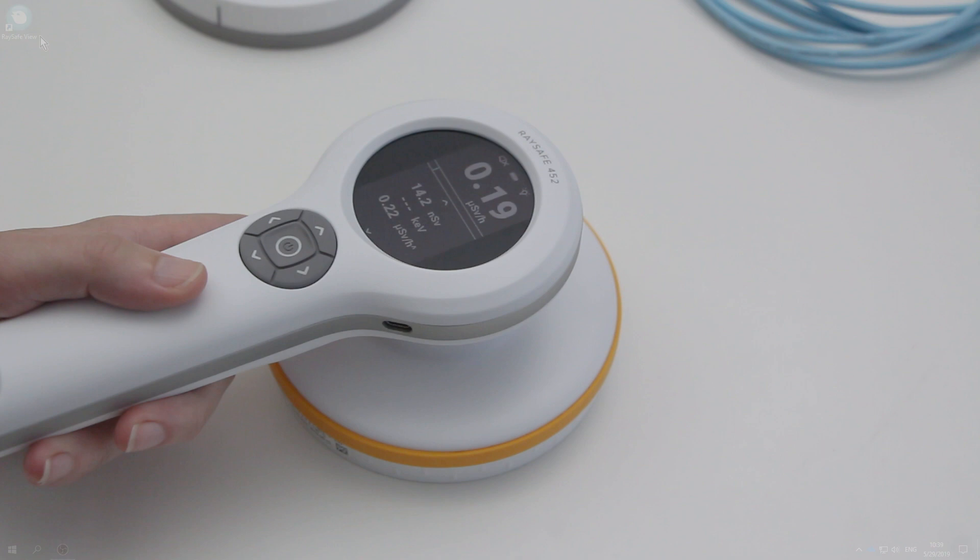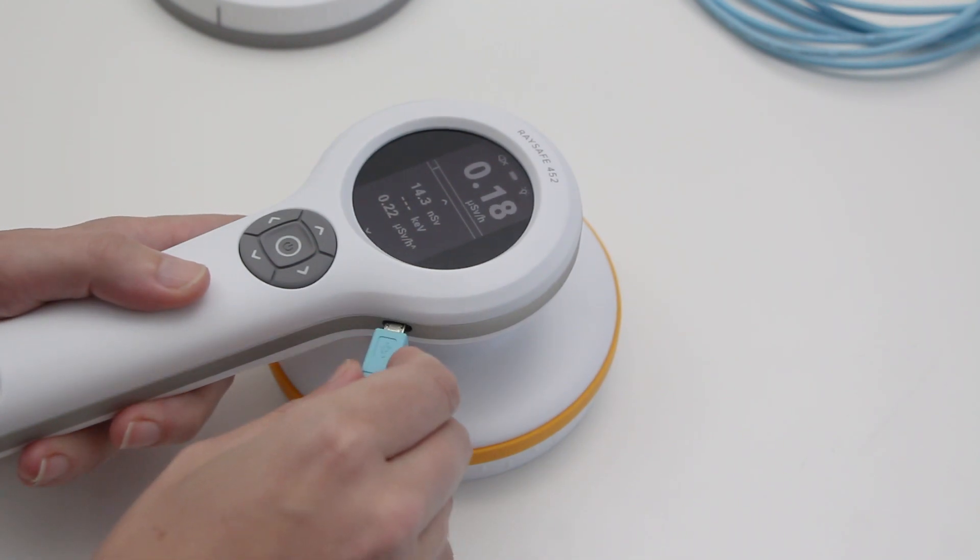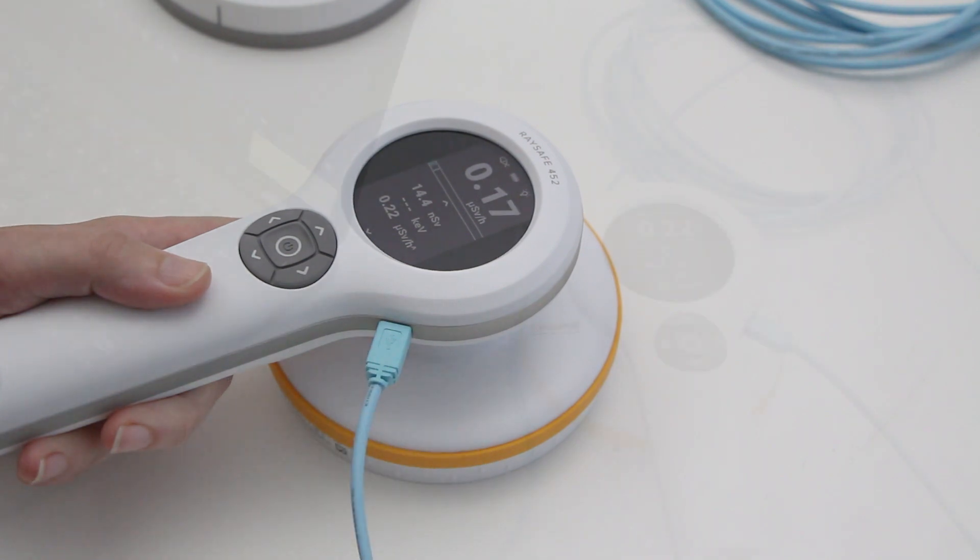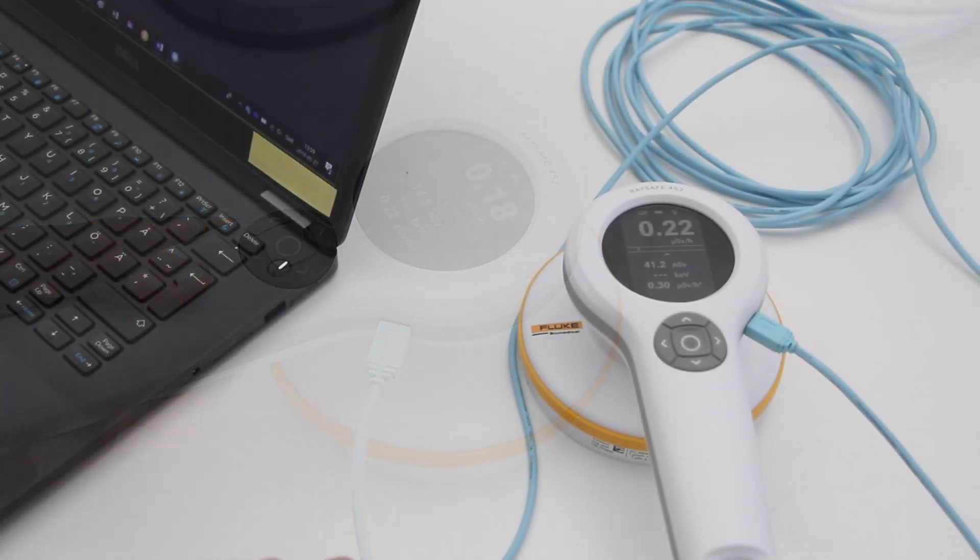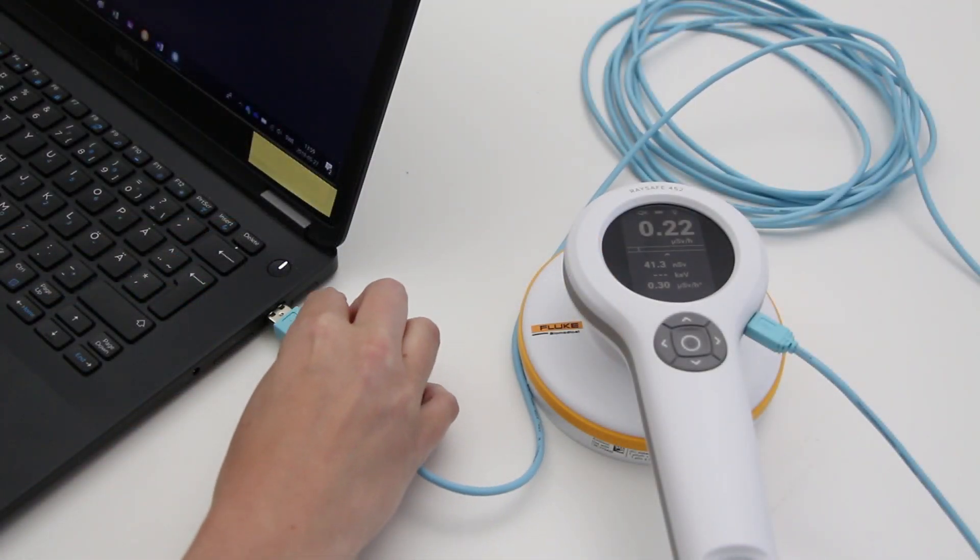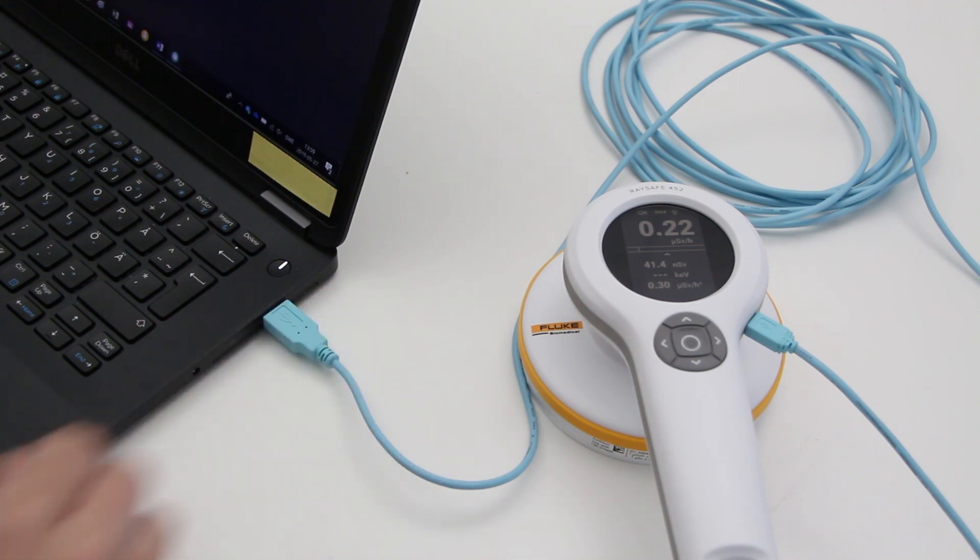The RaySafe 452 comes with a USB cable. Use it to connect the instrument to the PC. As a bonus, the battery is now charging.